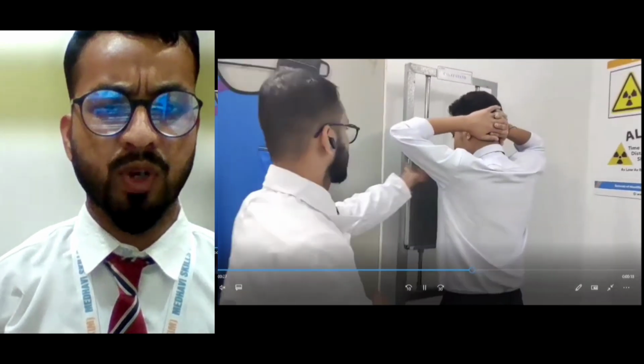Explain the process so the patient feels comfortable. First, the patient removes all materials like chains or buttons. The patient stands facing the X-ray cassette. Shoulders are rolled forward for a clear chest image. We ask the patient to take a deep breath and hold it while taking the X-ray.